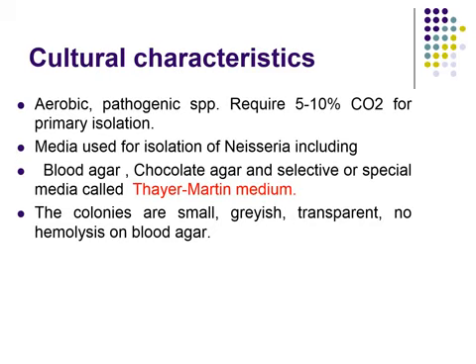Culture characteristics. So the first step in diagnosis of Neisseria disease, whatever the causative agent, you must select the proper specimen to be used according to the clinical manifestation.